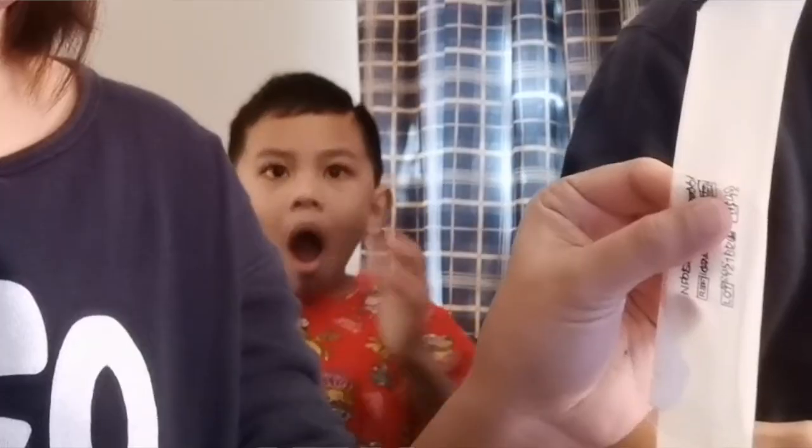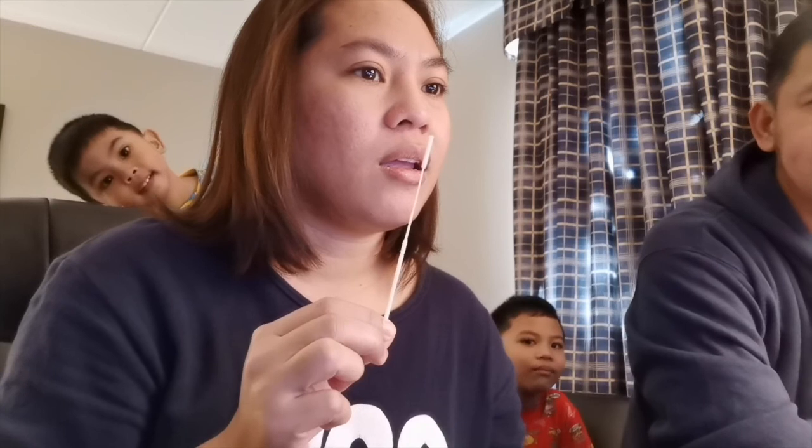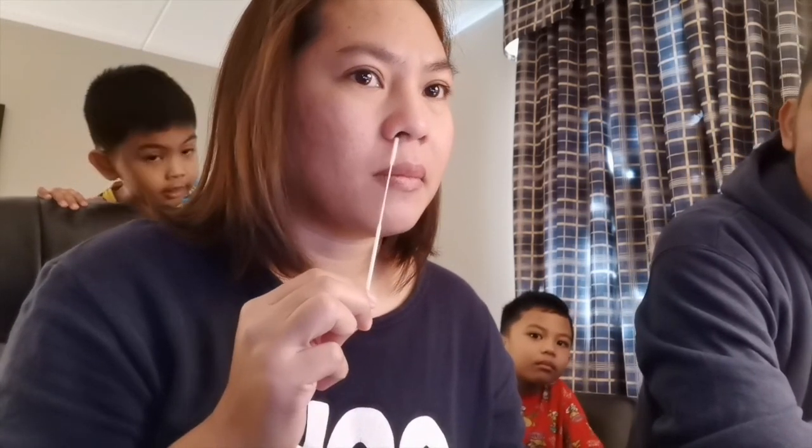And we're gonna insert it into your nose for 2 centimeters. Before we get started, we're gonna do 15 seconds in one nostril and then 15 seconds in the other. I'm gonna start the timer when you start on the first one. Once the 15 seconds is up, we'll do the 15 seconds on the other one. Ready? 1, 2, 3, go.